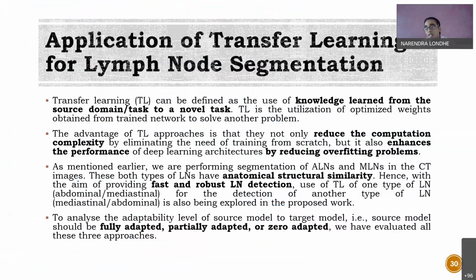Yes, there is a transfer learning concept. Transfer learning, in the sense, what does it mean? It means that the training of one network which is already trained will be transferred to another network which is not trained at all, a fresh network which requires training. So instead of training that network, I'm borrowing the training from another network and giving it to this network, and thereafter I will directly do the testing work. I'm not doing any training of that network. That is what is called transfer learning. I'm transferring the learning from one network to another network.